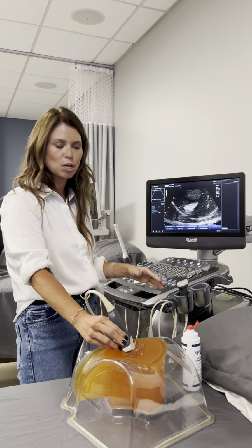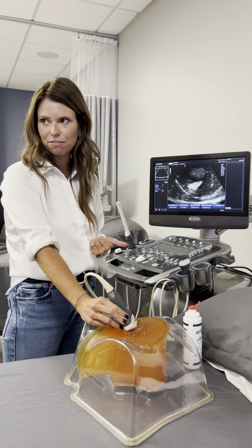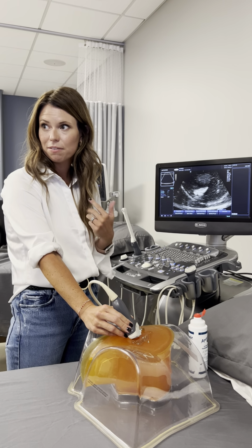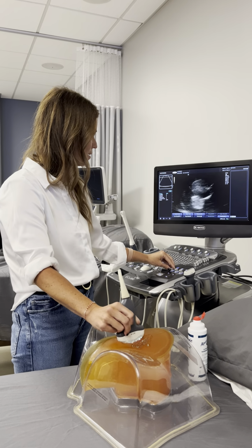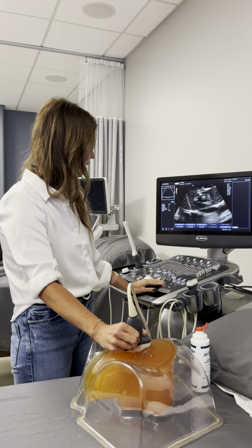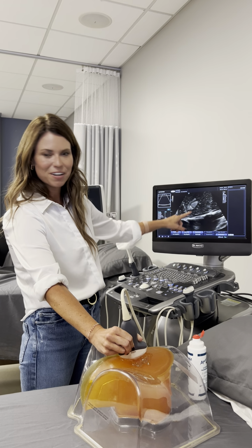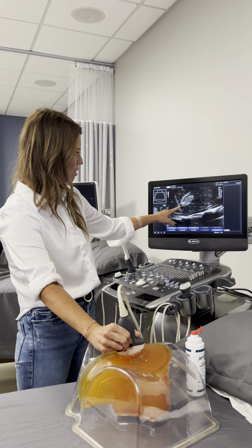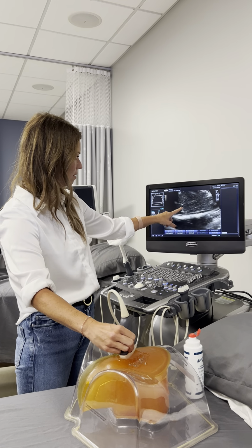Does that make sense? The reason we look at this is we're looking for abnormalities. We're looking for pathology. We have to scan the whole uterus back and forth because we're looking for fibroids. We're looking at the endometrium and its phase, and that's the best way to do that. So I think she has her ovaries. Okay, so then I would go out more, and you can see her little ovary right here. So then I'm going to survey that. I'm going to take a length measurement, an AP measurement, and a width measurement.